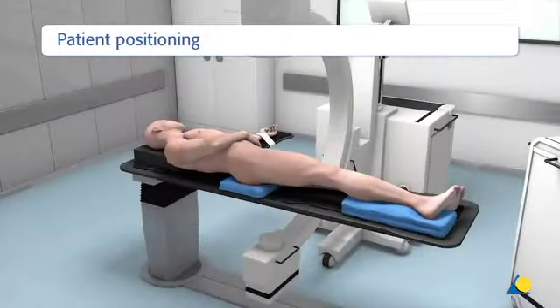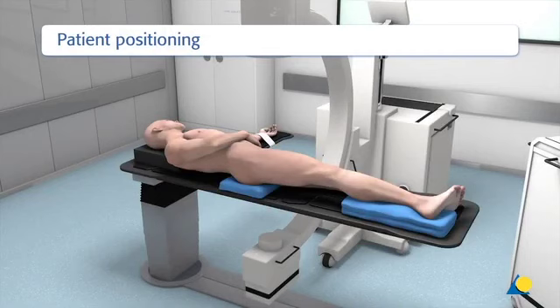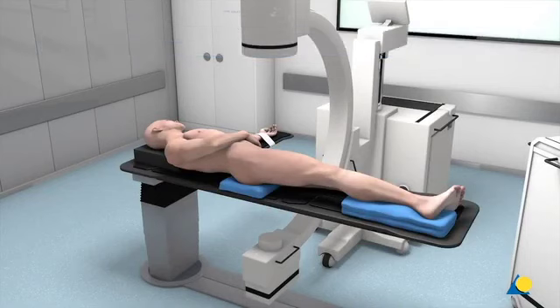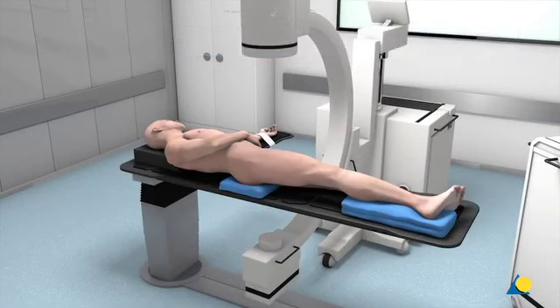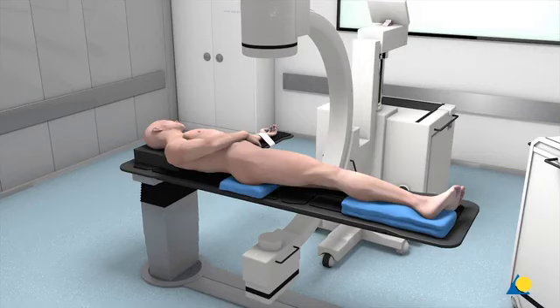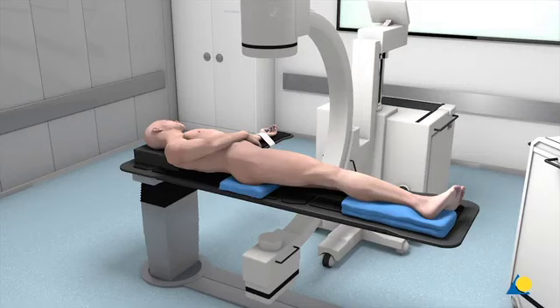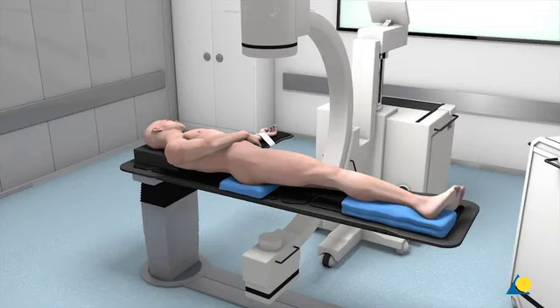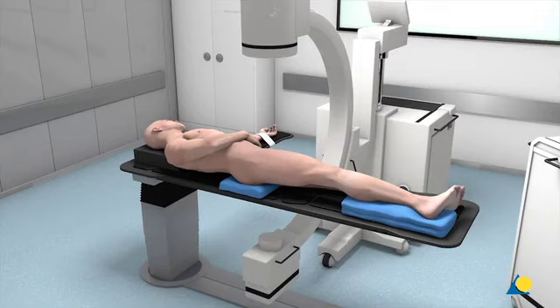The patient is positioned on a radiolucent operating table in a supine position with supports under the hip. A sandbag under the ipsilateral buttock rotates the limb and allows lateral and posterolateral access.